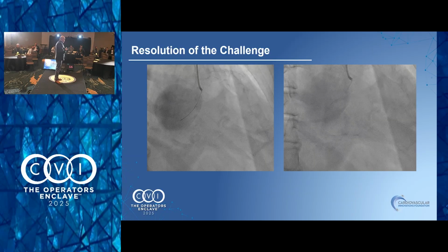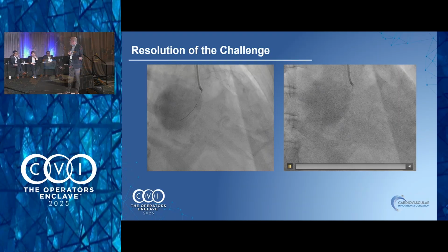It is playing a little bit. I don't know if on the right there you can see. Can you make that right image play, or maybe it'll do it on its own. There's not a small neck there, but on the right you'll see that I did wire something, and I injected contrast through the Caravel. That looked small to me, that distal.